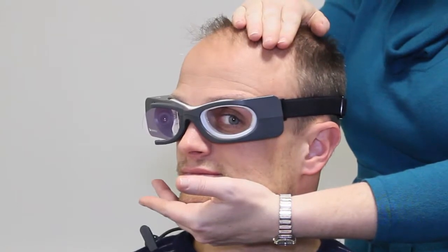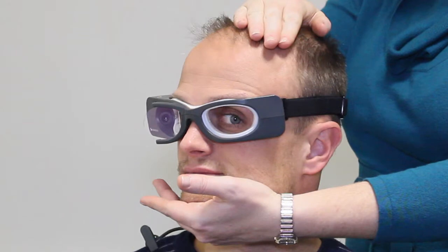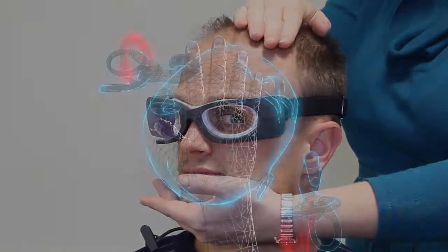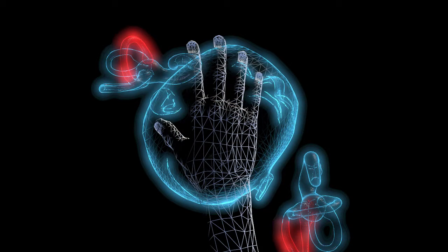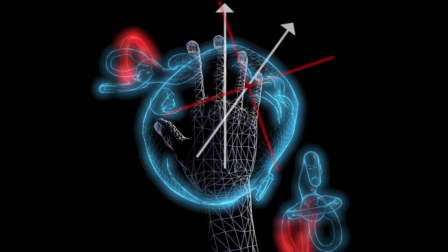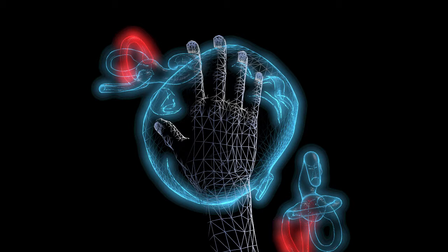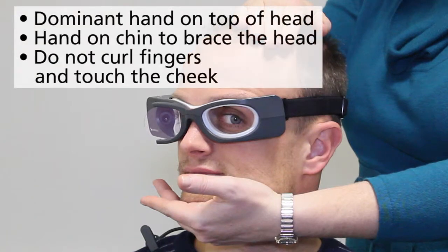Put one hand on the chin and the other hand on top of the head. The hand on top should be your dominant hand. Your fingers should be facing the fixation dot to ensure head impulses go towards the fixation dot and not towards the nose. The hand under the chin should just be bracing the chin — don't curl your fingers up the side of the cheek, as any cheek movement could move the goggle. Just brace the hand under the chin, and the other hand on top of the head.